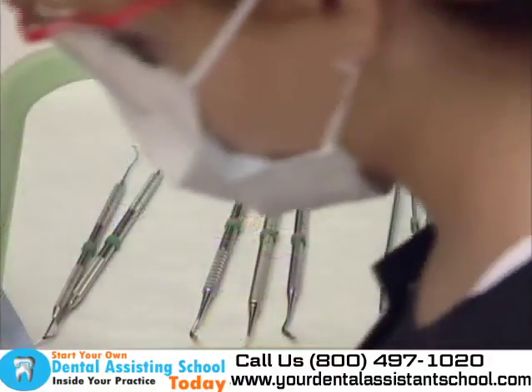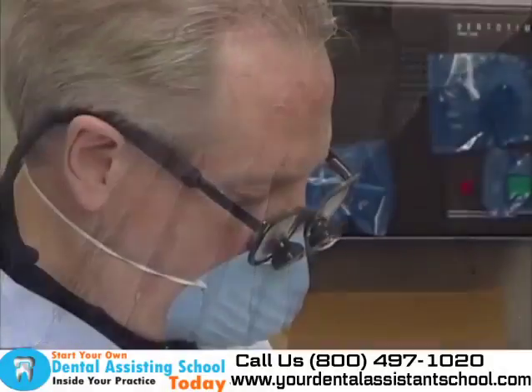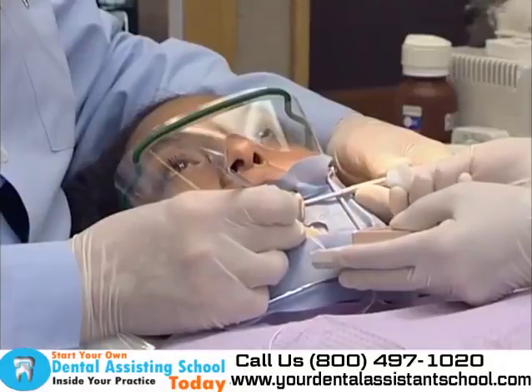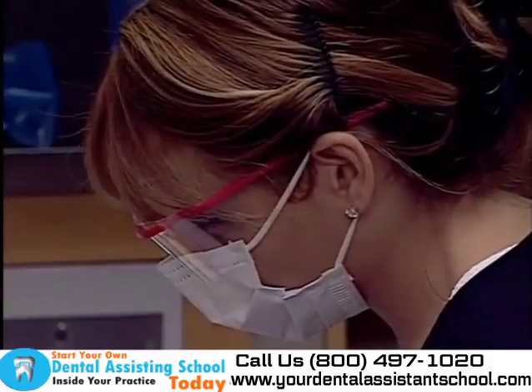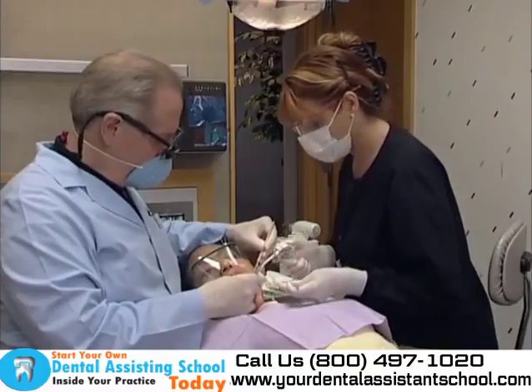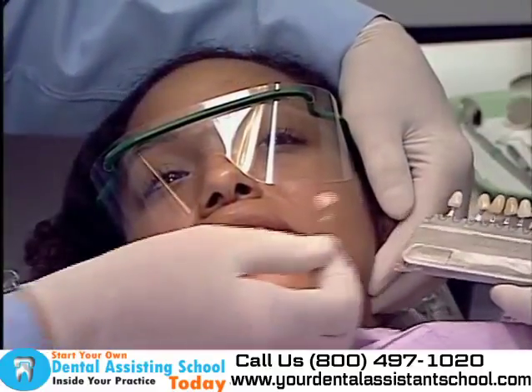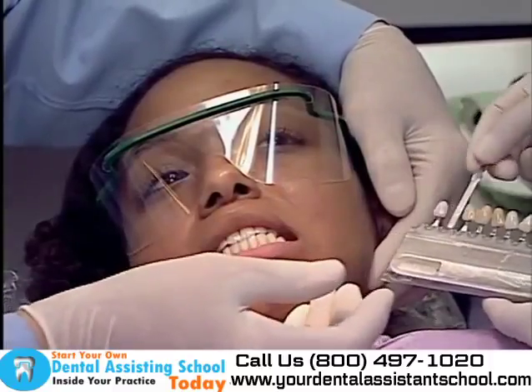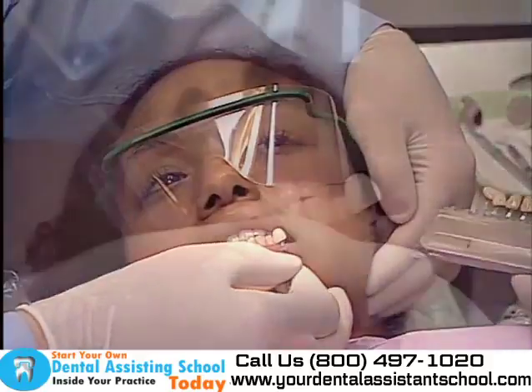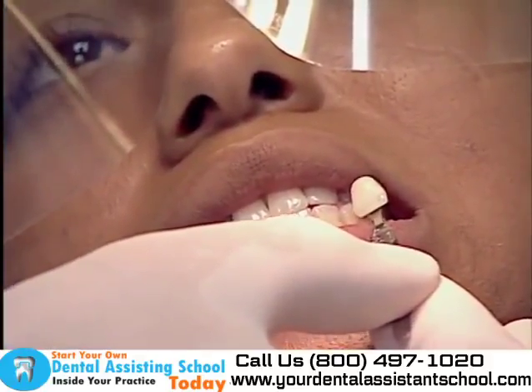There are many different instruments that are part of a particular tray setup. Most dentists have particular instruments they prefer to use. If the dental assistant is unsure about what the dentist's favorite instruments are, she or he should inquire. In a composite procedure, the dental assistant utilizes the shade guide to verify the color of the restoration will accurately match the color of the patient's natural teeth before the rubber dam is placed while the tooth is still moist.